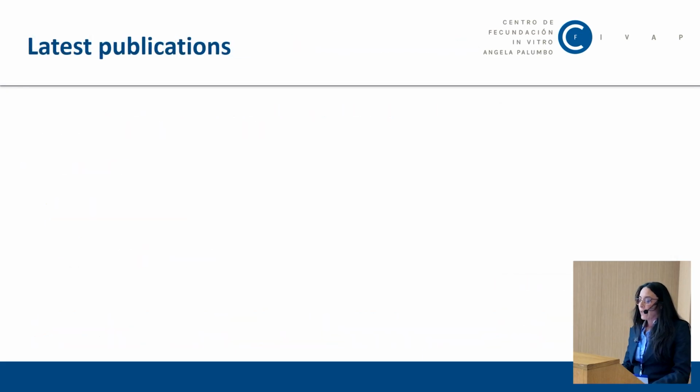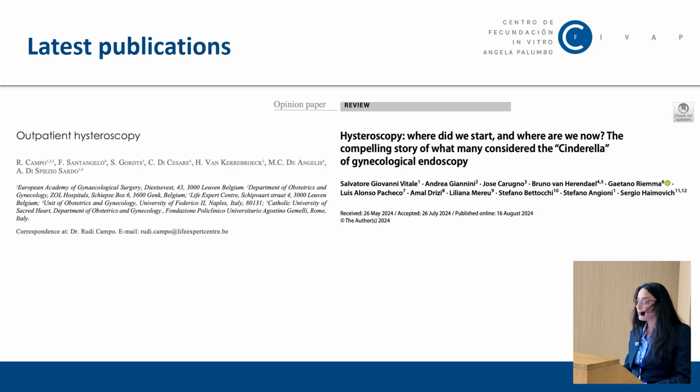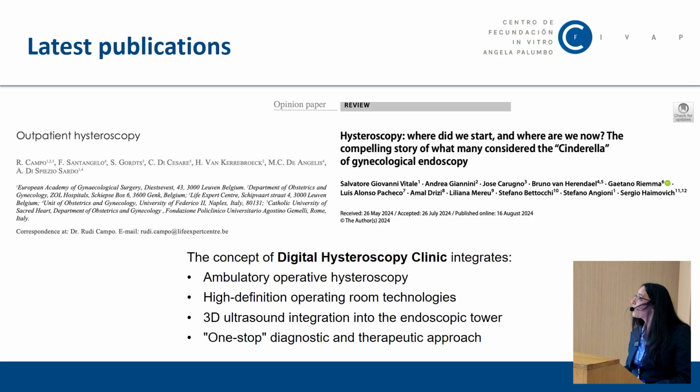Now, in the last few years, a few papers have been published highlighting the concept of the digital hysteroscopy clinic, which integrates ambulatory operative hysteroscopy, high-definition operating room technologies, and 3D ultrasound integrated into the endoscopic tower, and the concept of one-stop, only one step for the diagnostic and therapeutic approach.